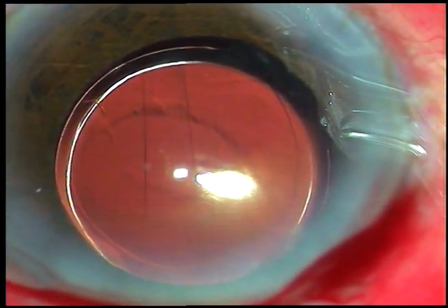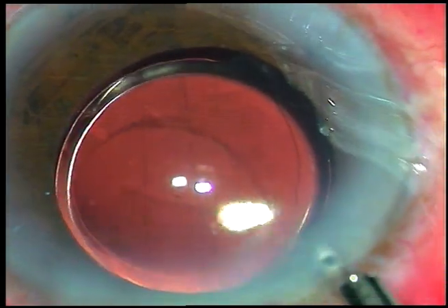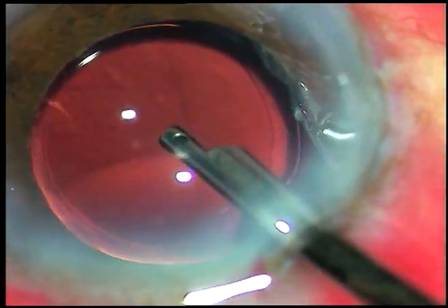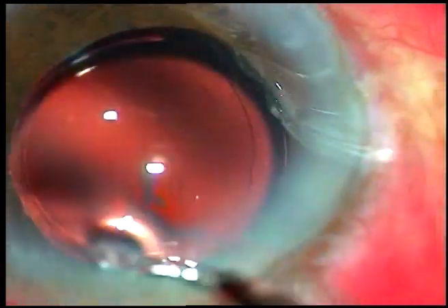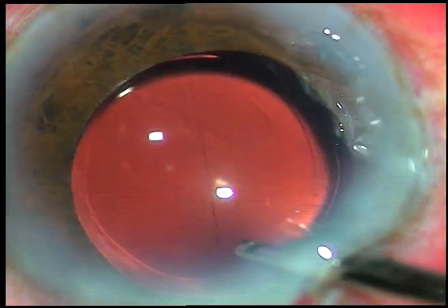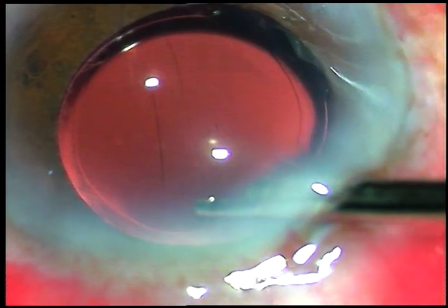Now the side ports are hydrated. This is the final irrigation of the anterior chamber. A lot of viscoelastic sticks to the corneal endothelium — the fluid wave is gently directed towards the corneal endothelium so all those viscoelastic substances come out. I don't get any rise of intraocular pressure because of retained viscoelastic. The anterior chamber is formed and the case is concluded.